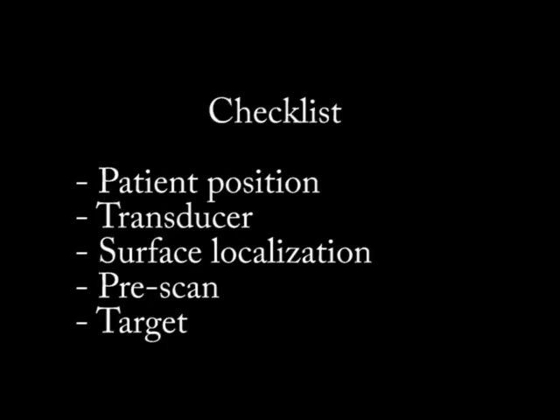Now, with injections that I do, I like to run through a checklist. So important things that we're going to talk about before the videos are ideal patient positioning, the transducer to use, what surface landmarks you can use to identify the GT, and where to put your ultrasound to start, things to look for on your pre-scan, and your target.